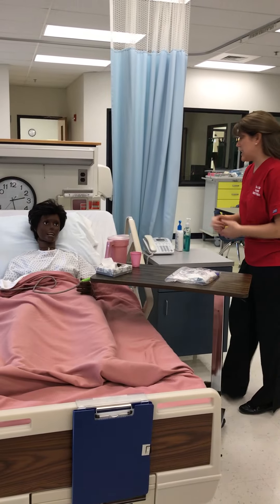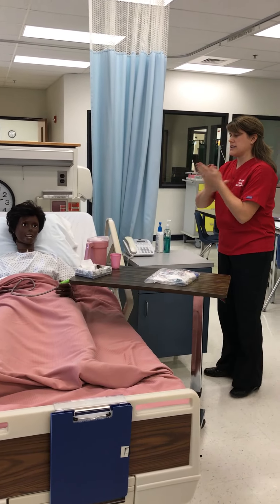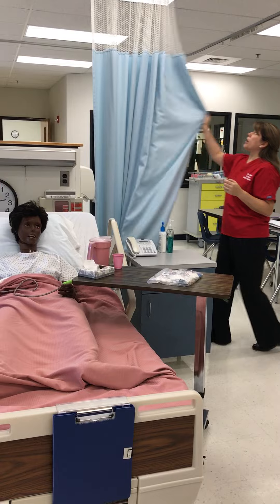With this skill, I'm going to do a little bit of talking through, and then I'm also going to demonstrate how we would talk to a patient. Opening procedures: Hi, my name is Jenny, I'm going to be your CNA today. Let me wash my hands. I'm going to provide you with some privacy.